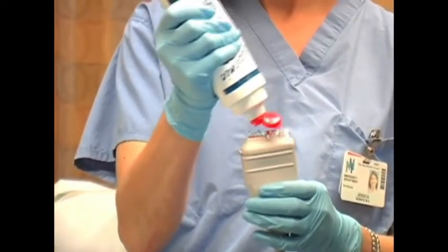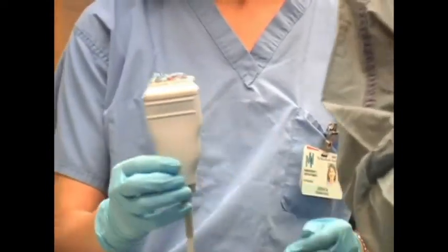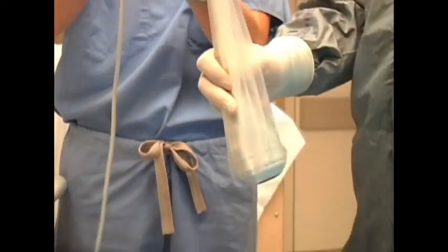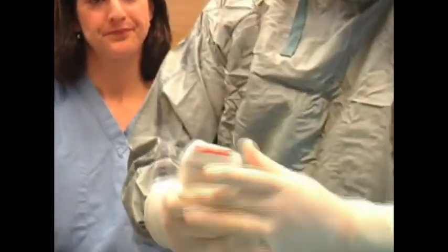Dr. Jessica Resnick is now preparing the transducer by putting non-sterile gel on the transducer head. Dan has folded up the sleeve much like a sock, and now Jessica drops the transducer into the sleeve. Dan smooths out the sleeve, and he stays sterile.